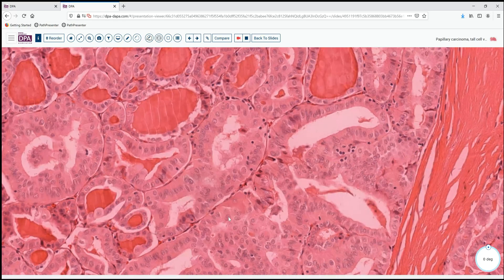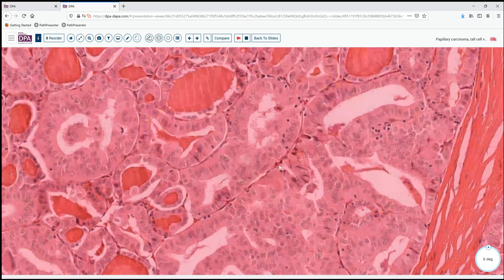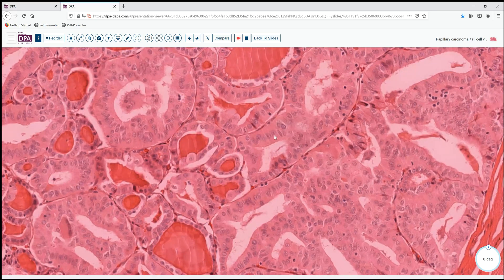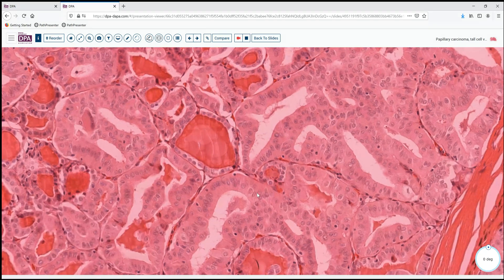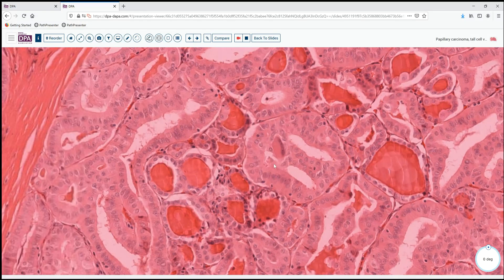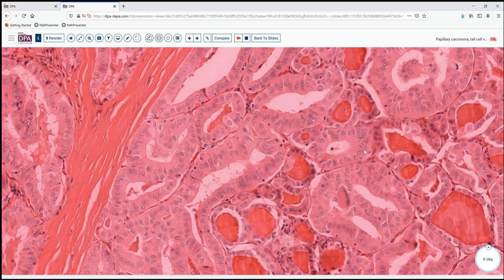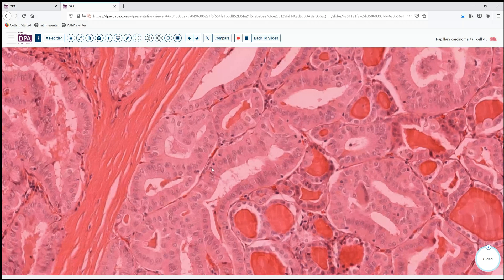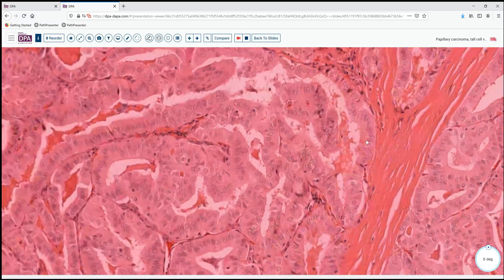Looking at another section from a related but different case, we can see another feature of this neoplasm is that the cytoplasm can be quite oxyphilic or quite eosinophilic, almost like a Hurthle cell lesion. And here we can see these tall cells with two to three times the amount of cytoplasm compared to the nucleus. This lesion also has some nuclear inclusions, not quite as pronounced or as vacuous as the previous slide. Here we can see more colloid type tissue as well, but again cells that are fairly tall and have abundant eosinophilic, slightly granular cytoplasm as a predominant feature.